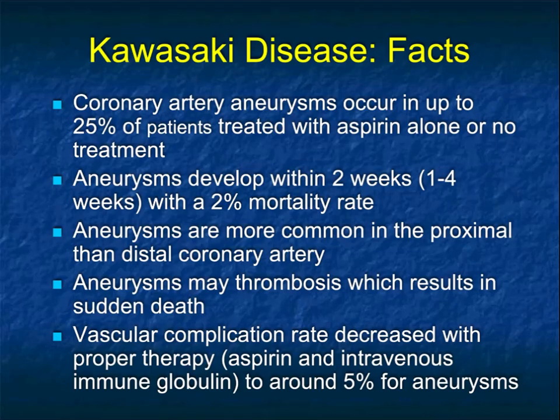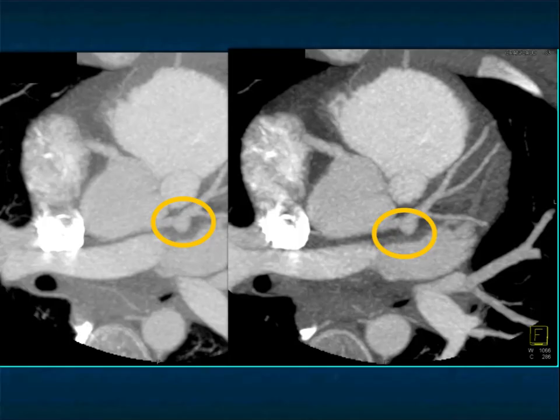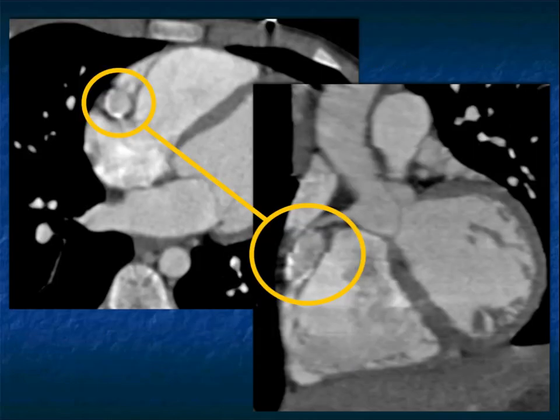There was a panic early in the COVID era when a cluster of Kawasaki cases appeared in New York and there was concern COVID infection was driving Kawasaki's — fortunately, that was not the case. Here's a nice example of an 8mm aneurysm of the left main coronary artery in an 11-year-old, about 10.5 years after the original diagnosis. You can see the aneurysm; there's no calcification in this one, but aneurysm calcification can occur. The aneurysms can be large and multiple.